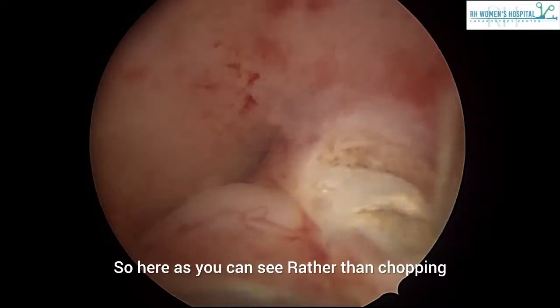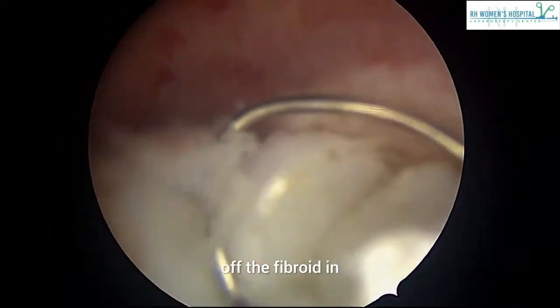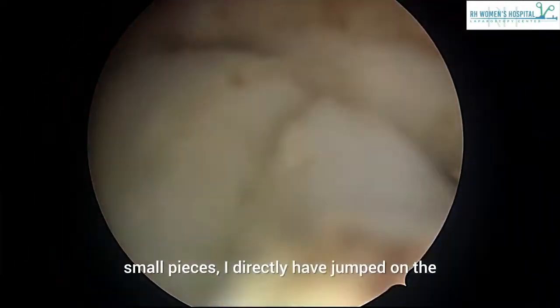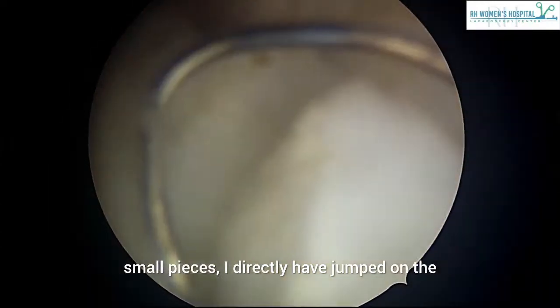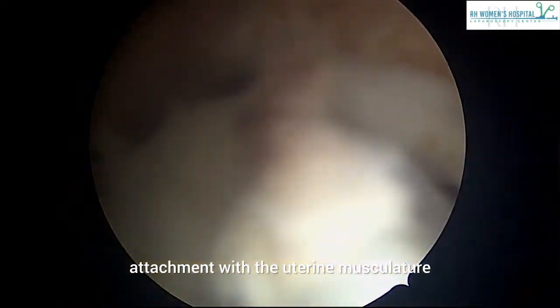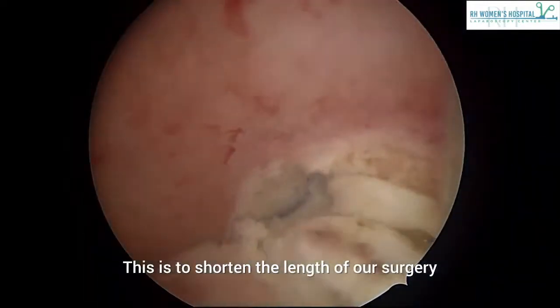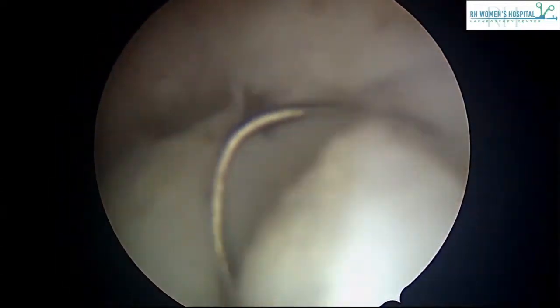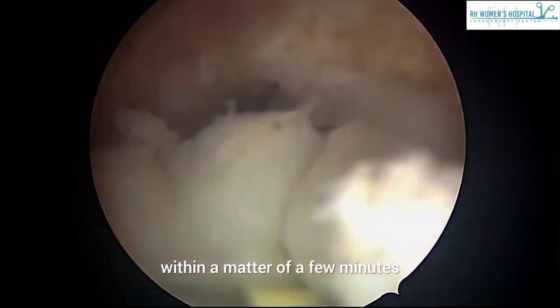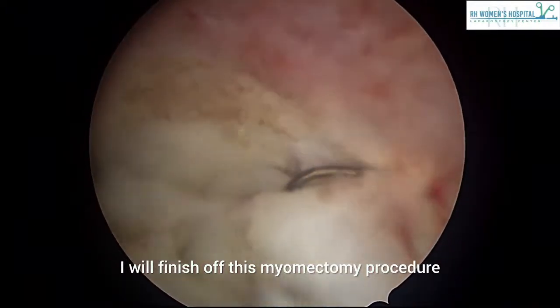So here, as you can see, rather than chopping off the fibroid in small pieces, I directly have jumped on the attachment with the uterine musculature. This is to shorten the length of our surgery, and as you can see, within a matter of few minutes, I will finish off this myomectomy procedure.